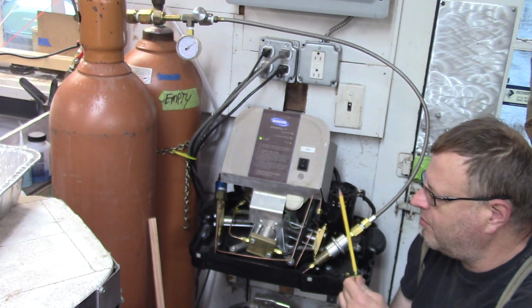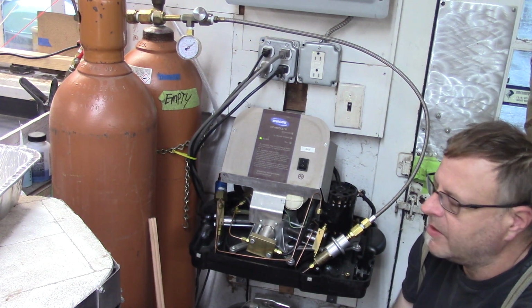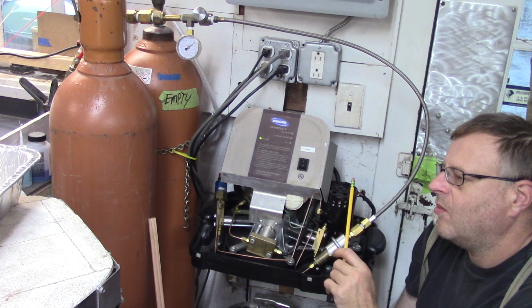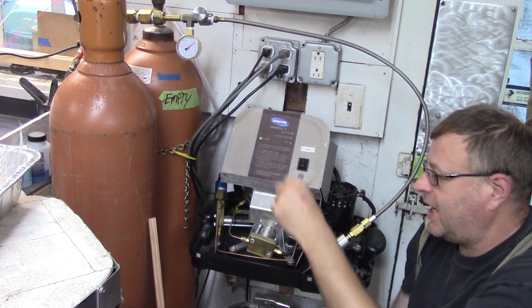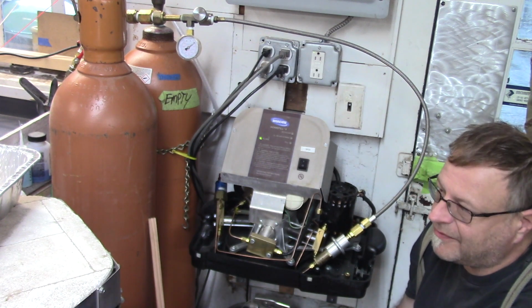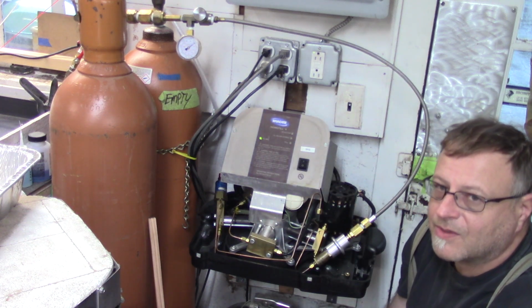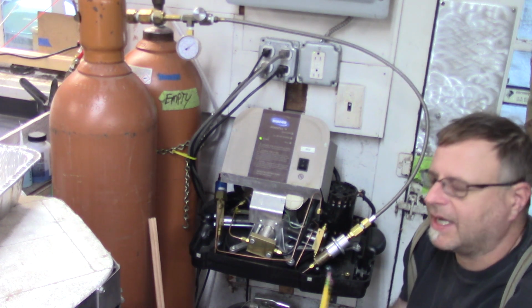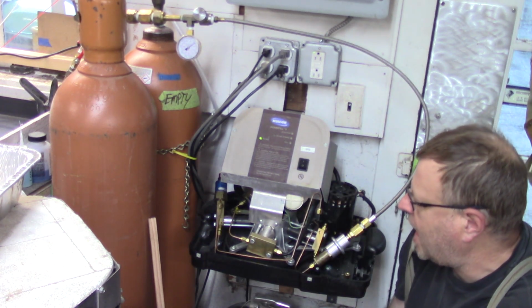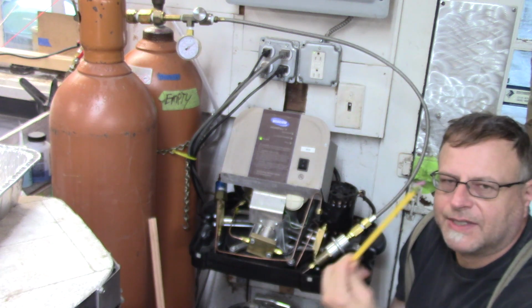Now, before I blew the pistons up, I would just let this thing run unattended because I had done the math to figure out how long it took to fill it. I now have done the math again, because I've changed the parameters of the way the machine fills. And I'm fairly confident that if I have about 400 PSI in this tank, I can let it run 10 or 11 hours while I sleep. I don't sleep 10 or 11 hours, but I can leave it sit for that long, chugging away before it fills the cylinders. I wouldn't do this, but I'm telling you how to do it, if that makes any sense.